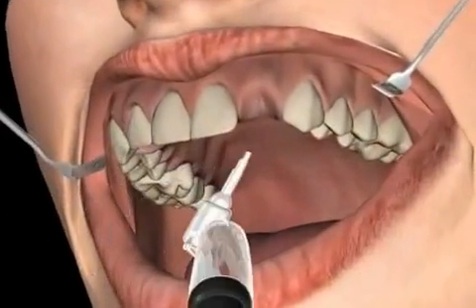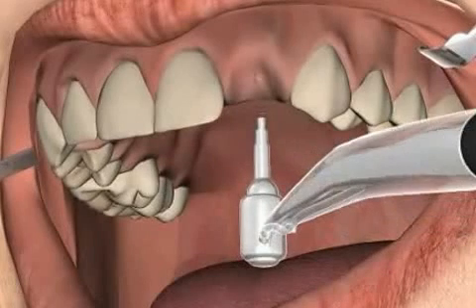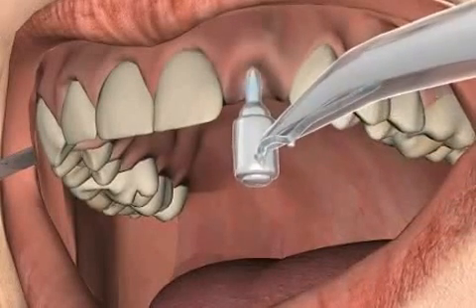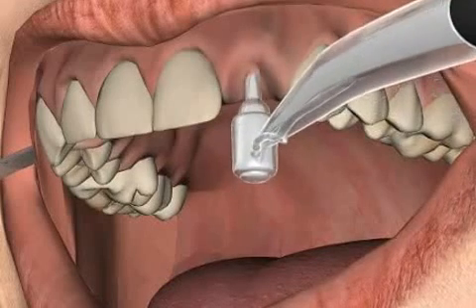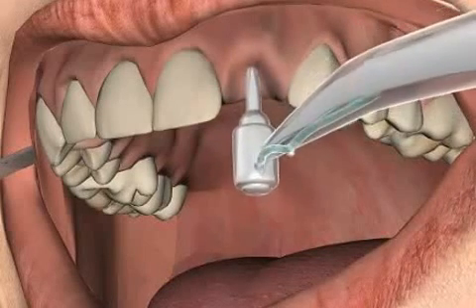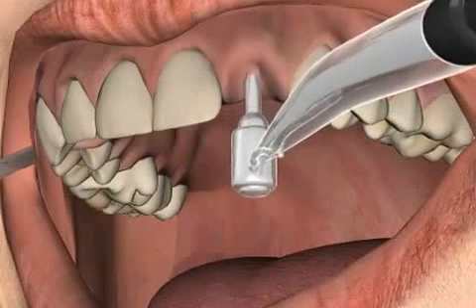Let's take a look at a video in which implants are exposed using punching methods. Here you see a female patient who has lost two teeth in an accident. An implant is supposed to be inserted into the upper jaw. Punching will allow the dentist to begin work on the implants by exposing them.